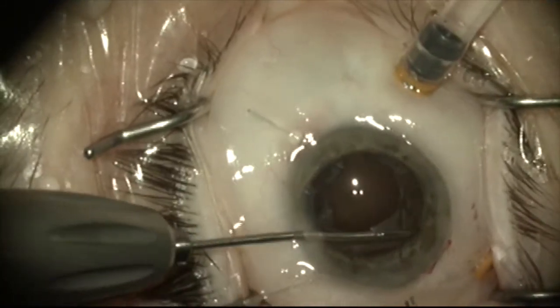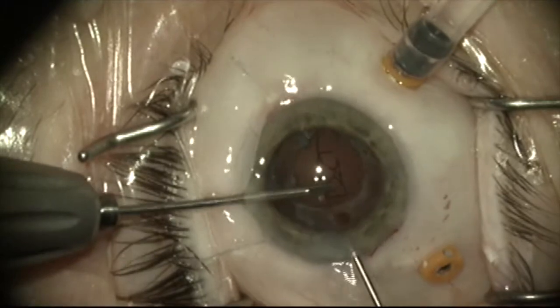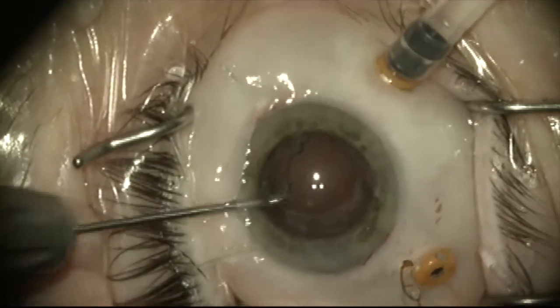So now I've made a decision that I'm going to try to dissect out completely this plate remnant at 6 o'clock because I don't want it to migrate into the visual axis over time. So I'm carefully dissecting out the remaining plate here and the whiskers.